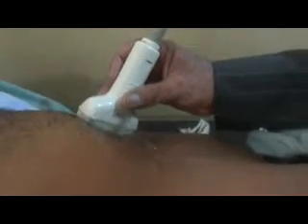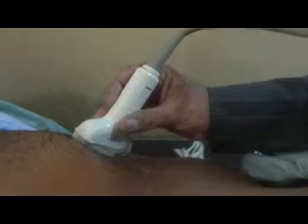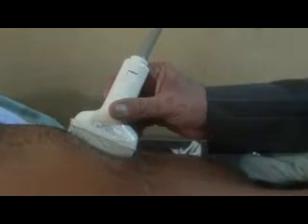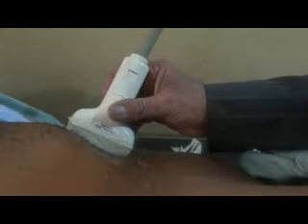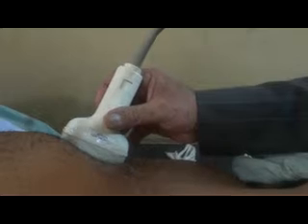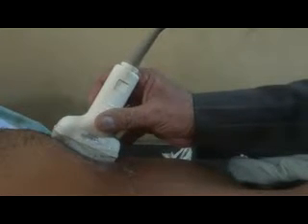In fact, in this patient, I am getting a proper view of the portal vein by placing the probe longitudinally in the mid subcostal region, angling the probe towards the patient's left side, and then pivoting it a bit.